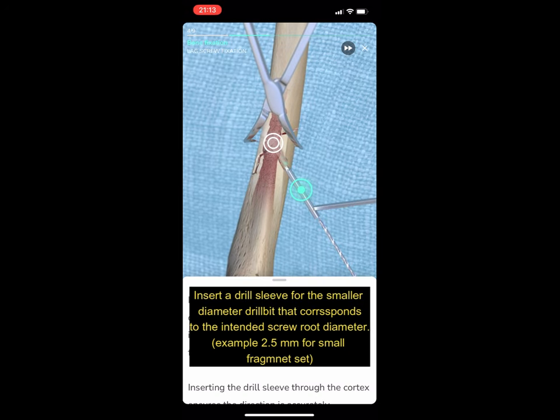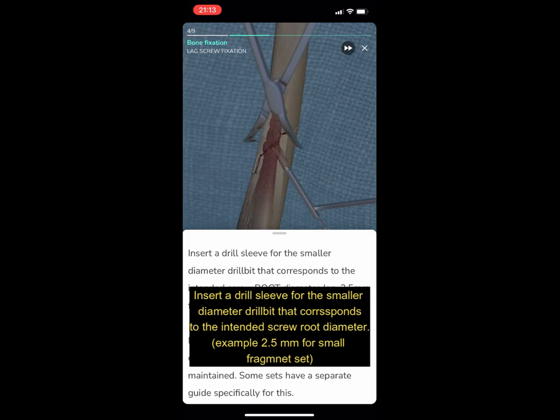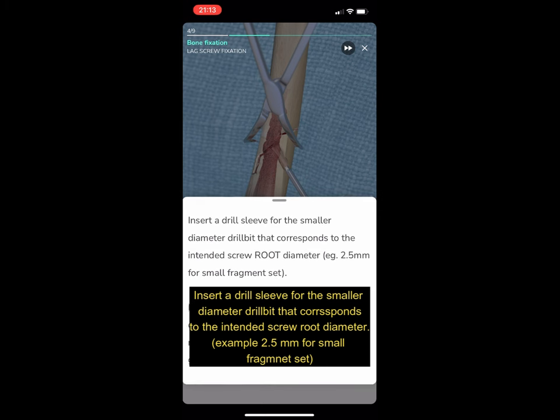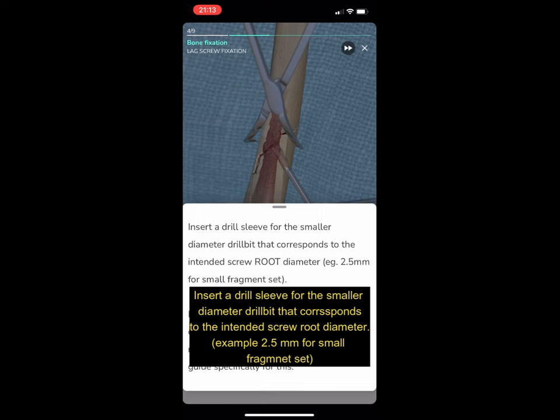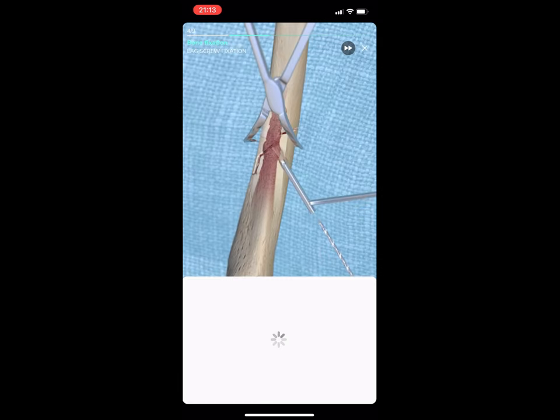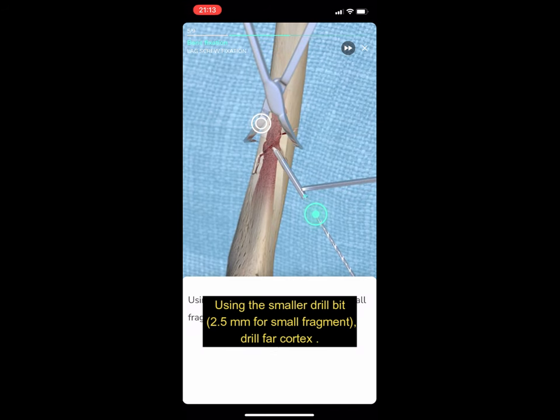Insert a drill sleeve for the smaller diameter drill bit that corresponds to the intended screw root diameter — for example, 2.5 mm for the small fragment set. Using the smaller 2.5 mm drill bit, drill the far cortex.